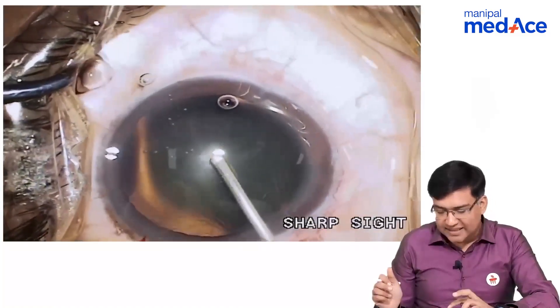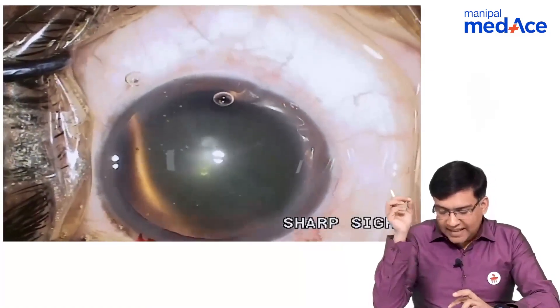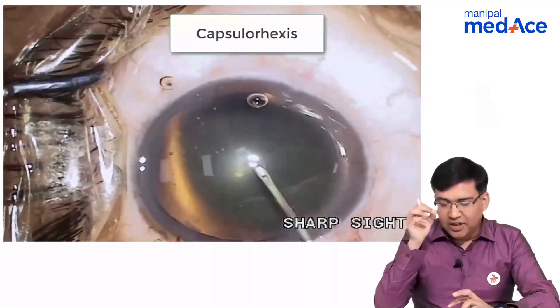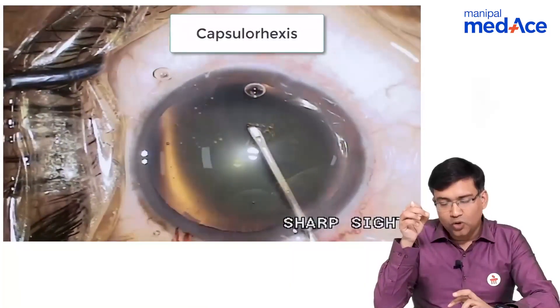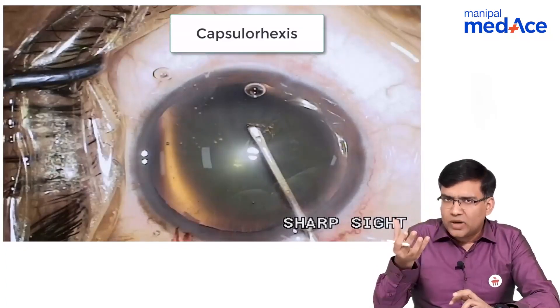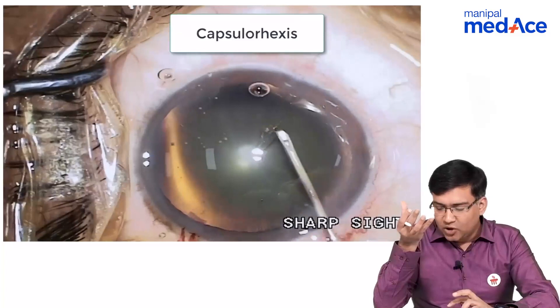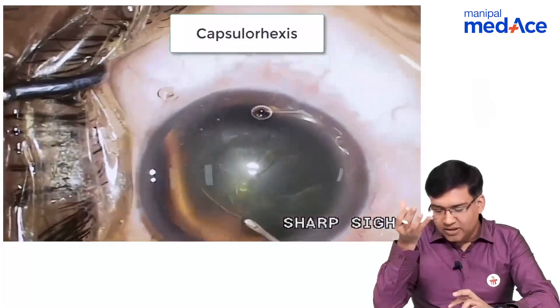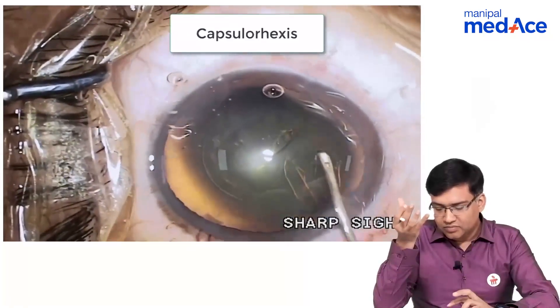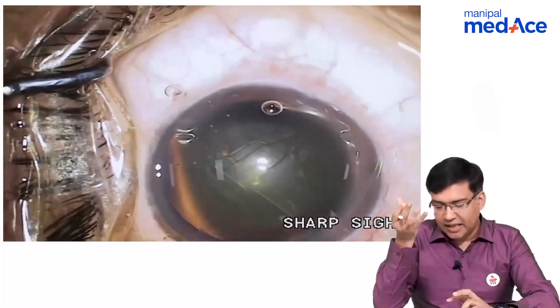Putting some more viscoelastic inside. The next step is with the help of a bent 26 gauge needle, we make an opening in the capsule of the lens. We can stain the capsule with the help of trypan blue dye, or we can do it without that if we are getting good retro illumination. Here we are doing it without the dye and basically making an opening in the capsule that is called a continuous curvilinear capsulorhexis.